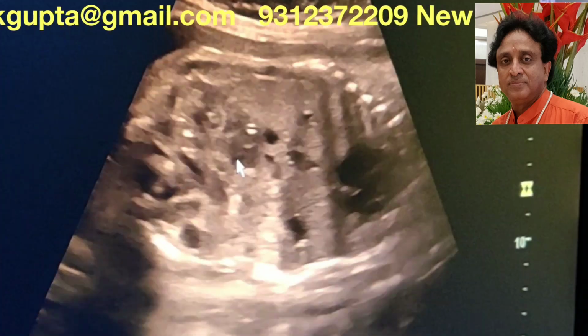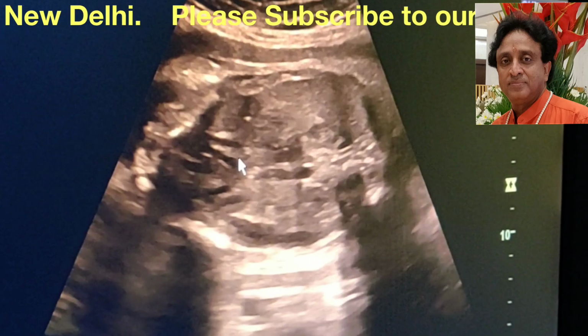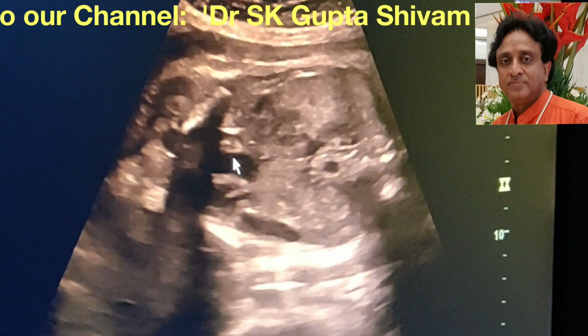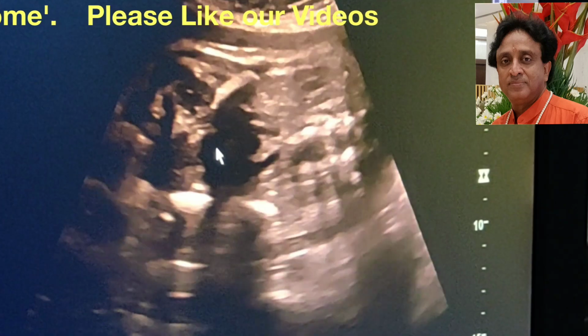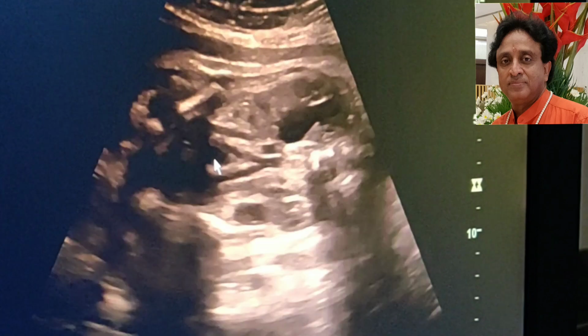But if we find that the proximal ureter is dilated, as we are seeing here, it is unlikely that we are dealing with a case of PUJ obstruction. Then it has to be vesicoureteric reflux only.